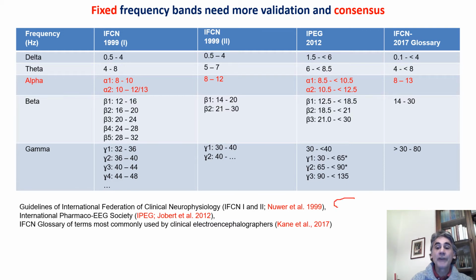The review of the literature showed that there were several suggestions about the frequency bands from the International Federation of Clinical Neurophysiology and the International Pharmaco-EEG Society.